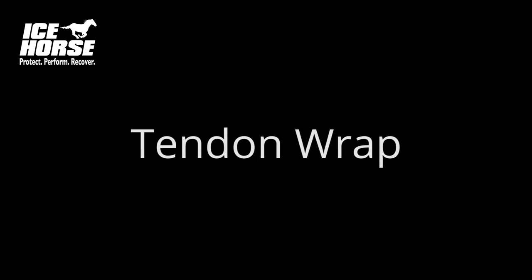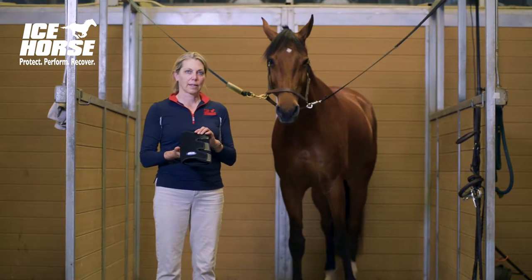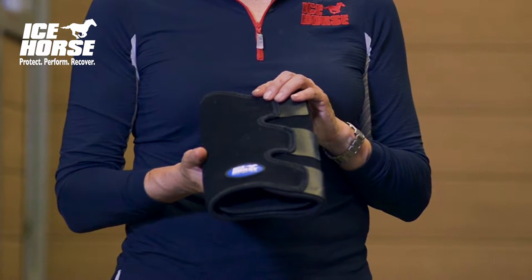This is the Icehorse Tendon Wrap. This is an easy to use wrap for treating tendon injuries, suspensory problems, or for general all-purpose use after exercise.